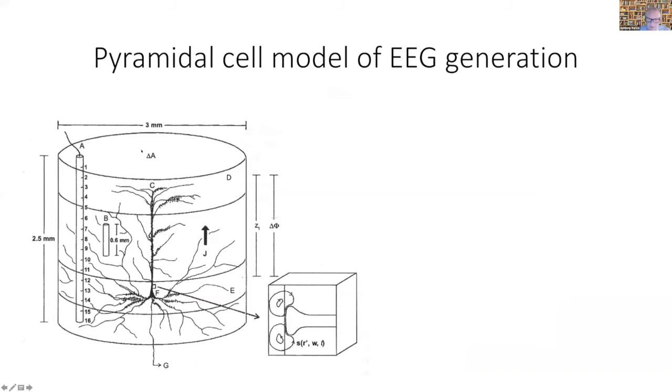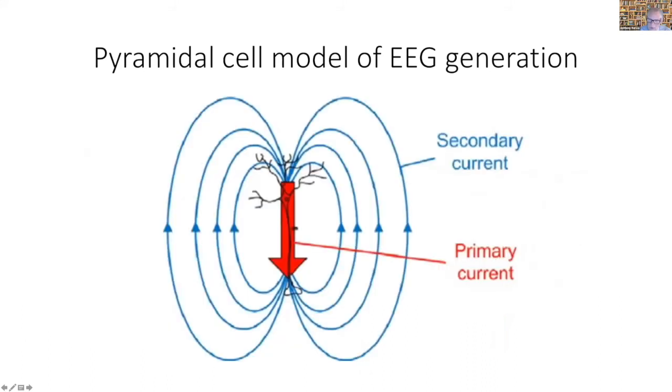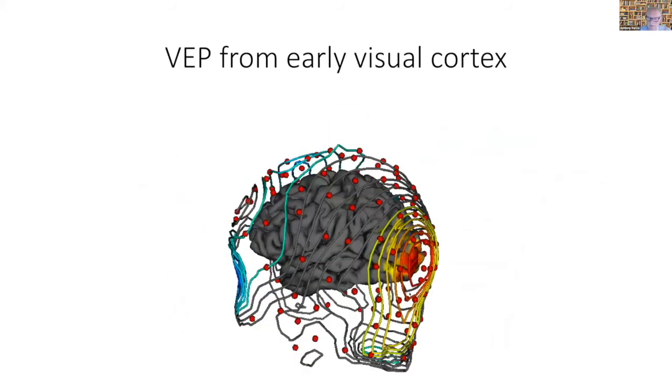So they have an orientation which is critical, because as synaptic activity dumps current into these cells, it flows in an elongated direction. And this allows for what's called a far field to be generated. So there's a current flowing in the cell. This generates a radiated field that we can then pick up on the sensor array here. And so this is an imaging modality where we're taking the measurements on the sensors and tracing them back to where they were generated in cortex.